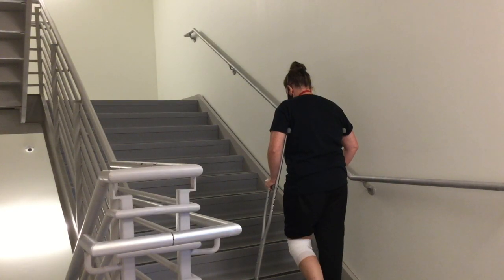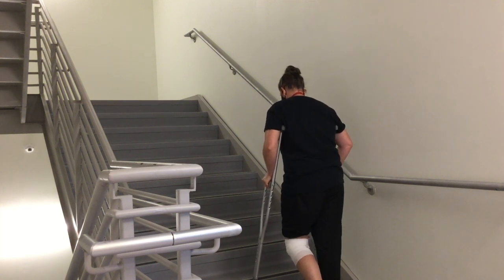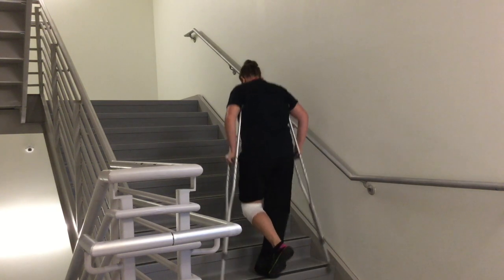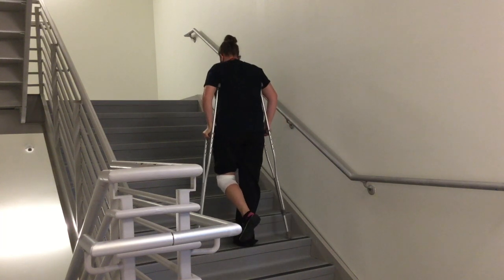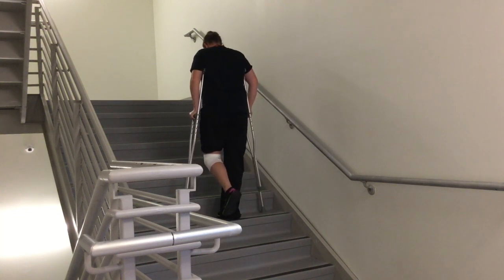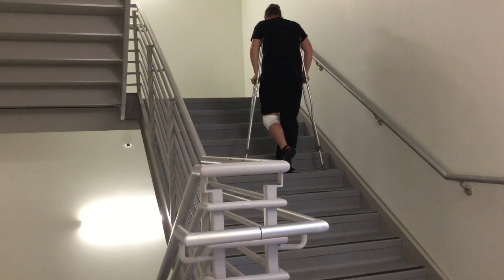To climb stairs with crutches, instruct the patient to start at the bottom of the stairs in the tripod position. Hold the patient's gait belt securely. Have the patient transfer all the weight to the crutches and use the uninjured leg to step up to the first stair. Instruct the patient to straighten their knee on their uninjured leg and lift their body weight, bringing the crutches up to the injured leg stair. Continue this sequence until you reach the top of the stairs.